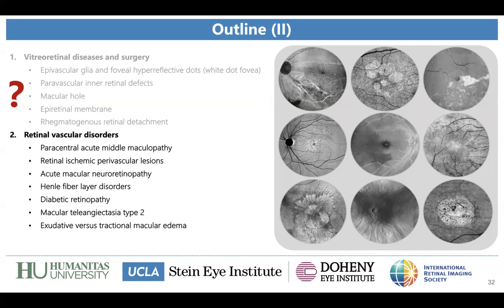Following the same line of thinking, there are many reading centers nowadays. They use the en face OCT to measure the area of the ellipsoid zone, for instance, for degenerative disorders such as retinitis pigmentosa.